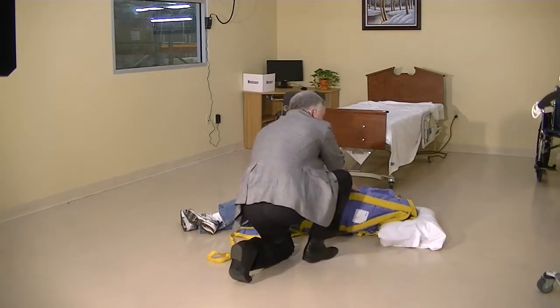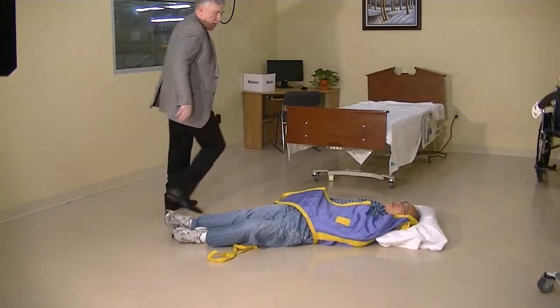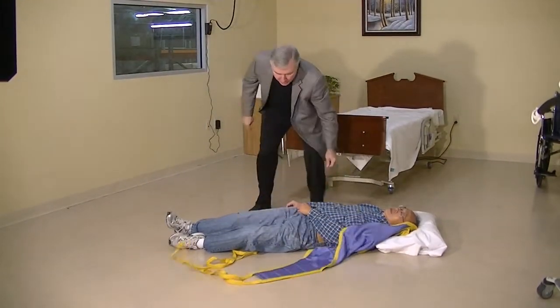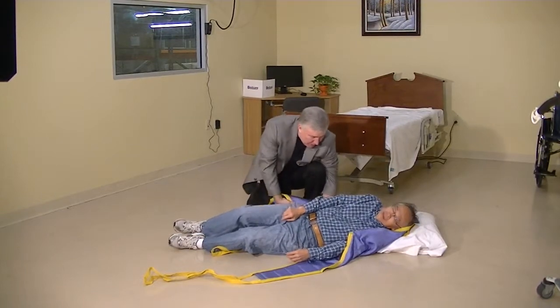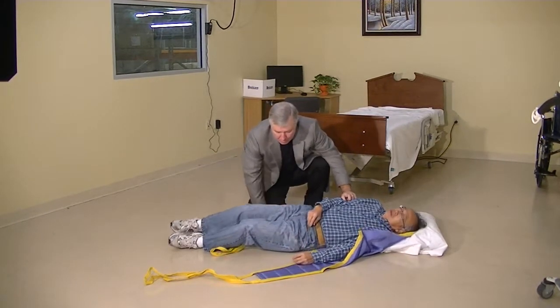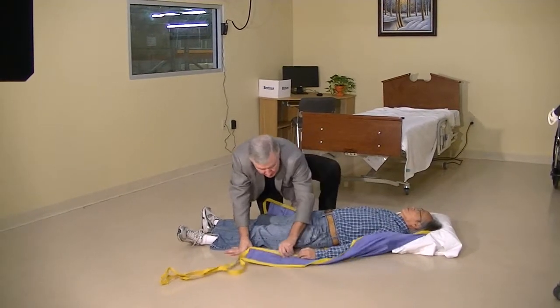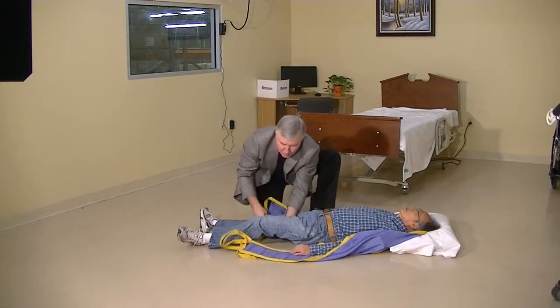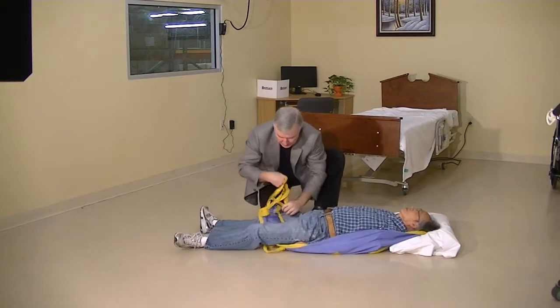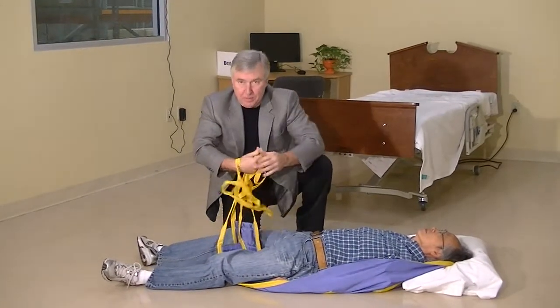The next step — because we're going to roll the patient back — we're going to step around to the other side, and we can take a little grab here. The patient can roll over just a little bit, and now the sling is in place. The last step is to take the leg straps, bring them underneath the legs, and cross them.